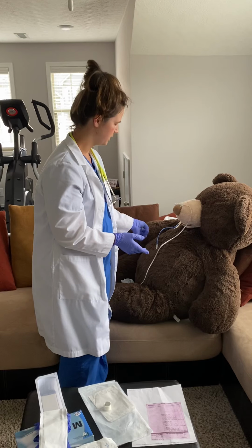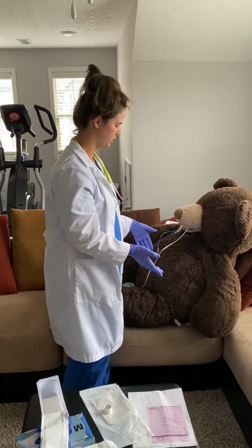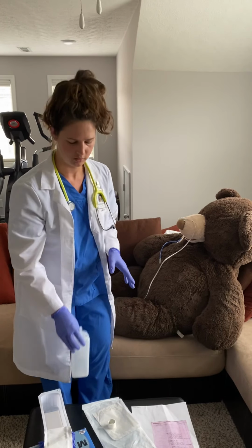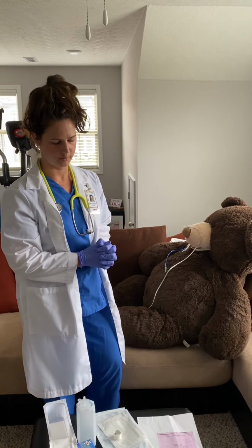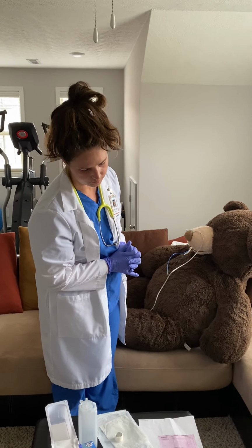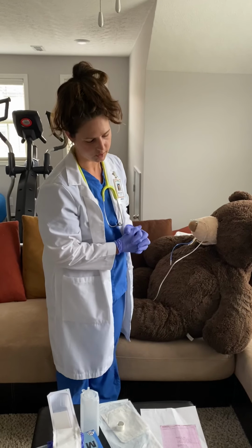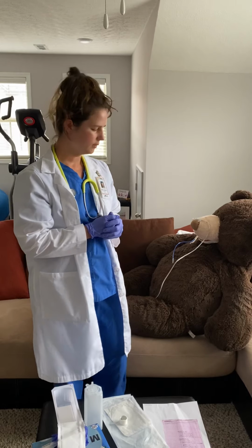And let's see here. Make sure their call light is within reach, their personal belongings are within reach. Report any abnormal findings to the charge nurse, and also make sure you document those as well. And we're going to be flushing it every 4 hours per the order, checking for residual. Okay, and I believe that is it.